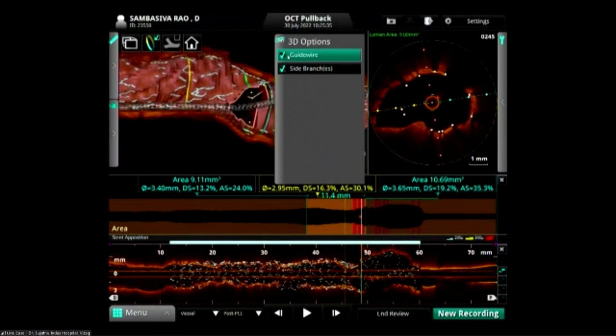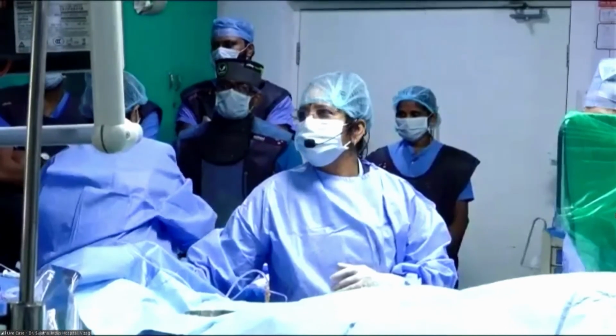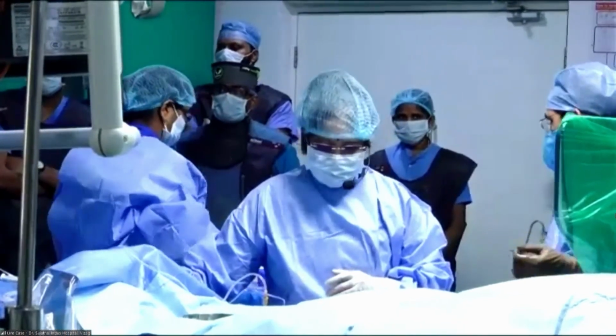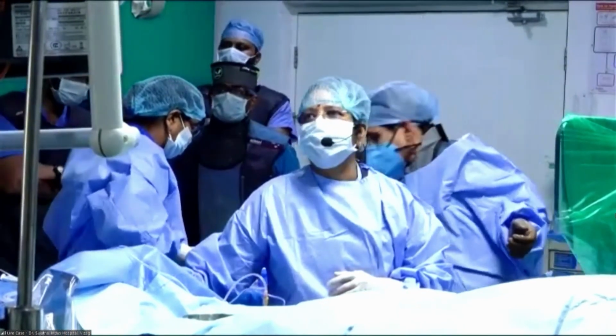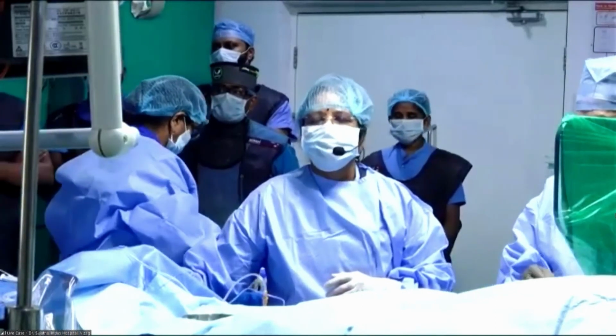Thank you, madam. Congratulations. I think that's fantastic. Yeah, I think we can go and look at the distal circumflex if you want with the direct stent later on, or in this setting, madam. It looks like a straightforward short lesion. Yeah, you can address that. Perfect job. Excellent. Thank you very much for your demonstration.